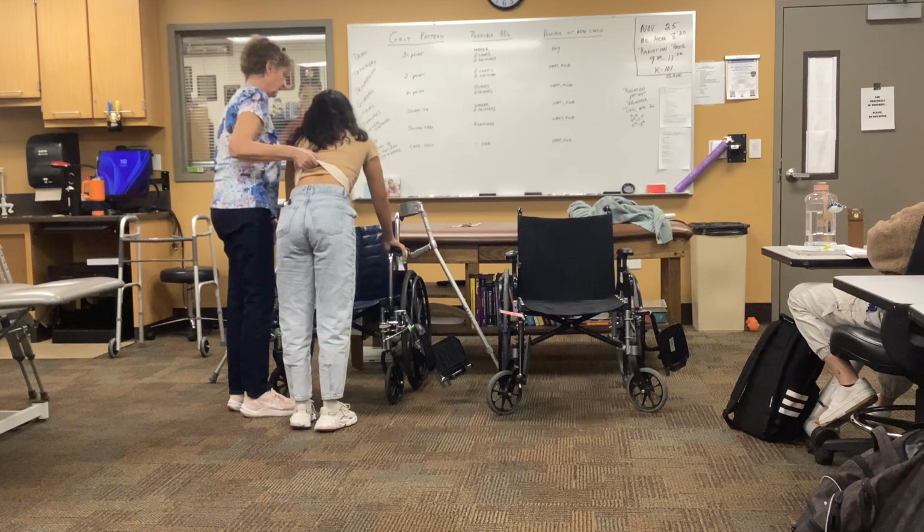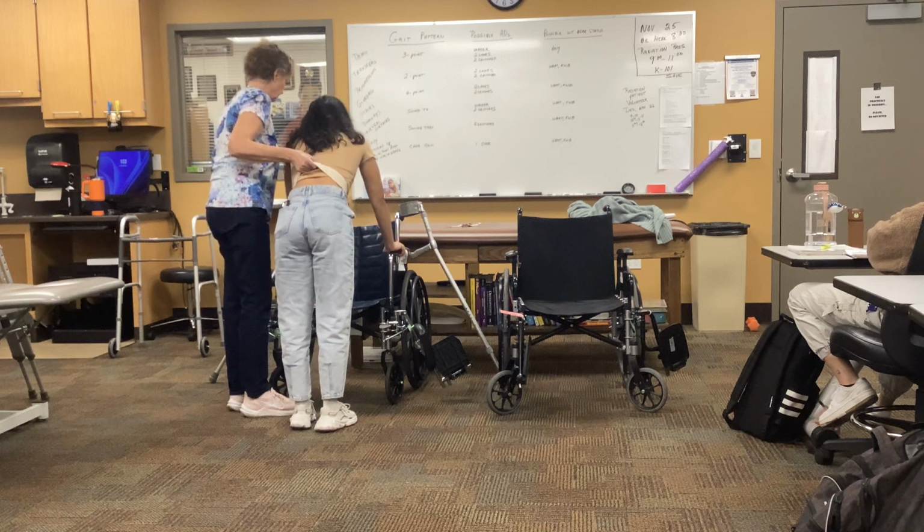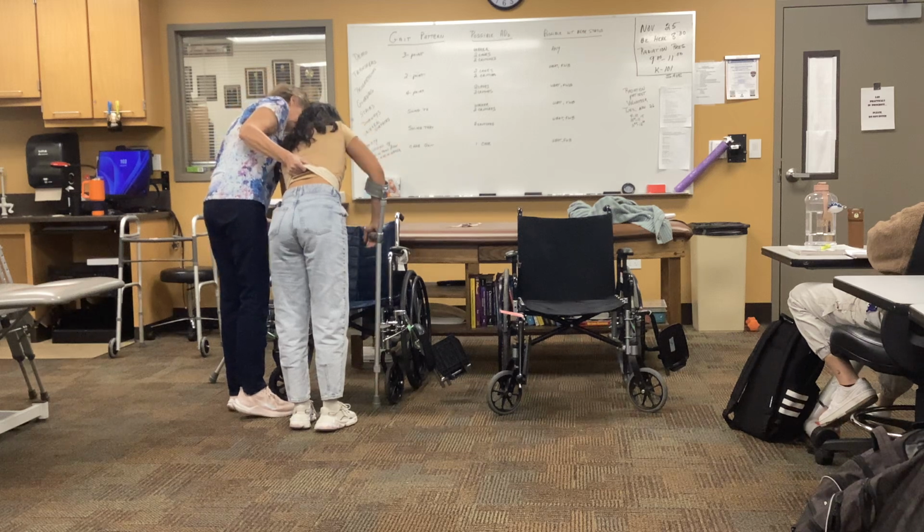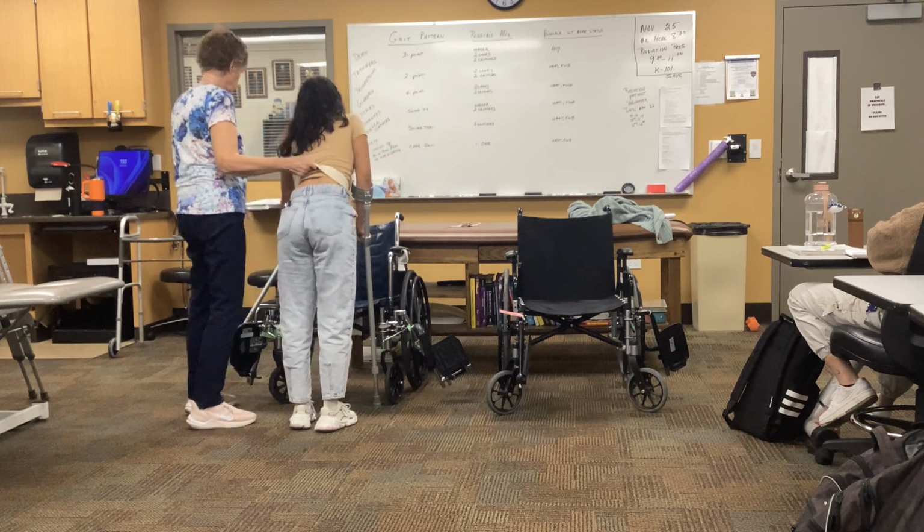Good. Now she's going to lean forward, get one crutch, and get the other one.